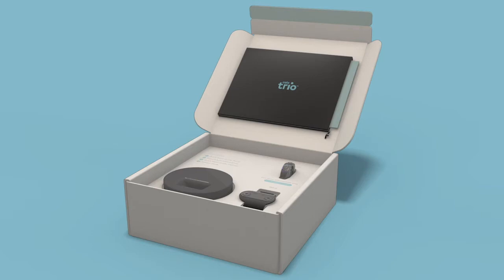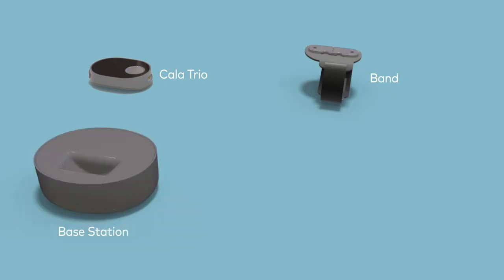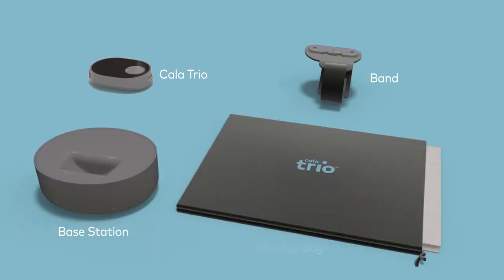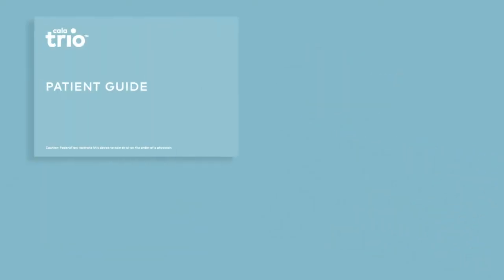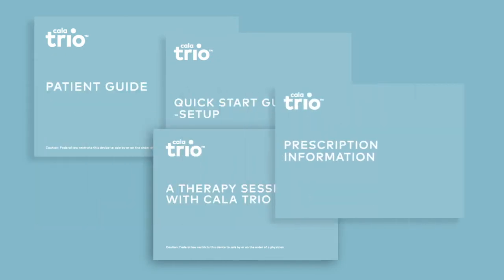As you remove the contents of the box, you'll find the stimulator, the band, the base station, and a storage bag. Inside the storage bag, you'll find a handy user manual and patient guide, two quick start guides, and your prescription information.